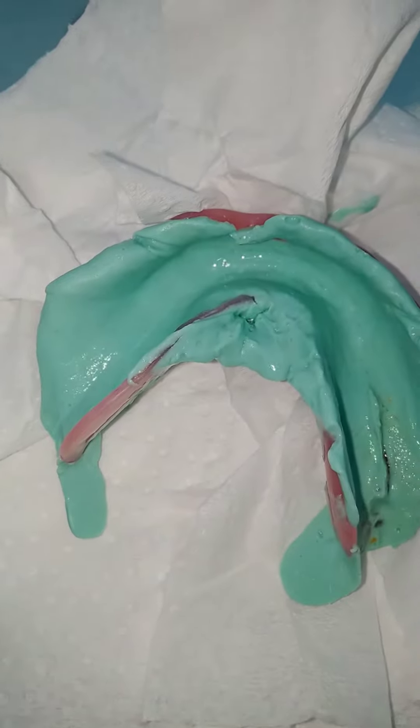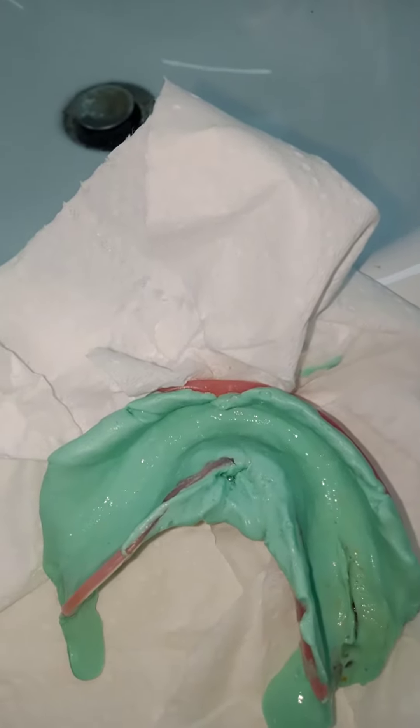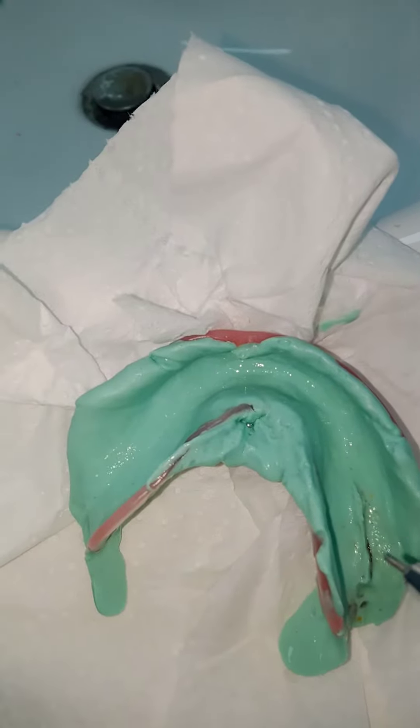Do you think this denture is adapted in place? The material is thick. One problem might be that your mix was thick. If it was a bit thick, it would produce this maladaptation. I want it thin, so we're going to solve this by thinning out the alginate and see the result.